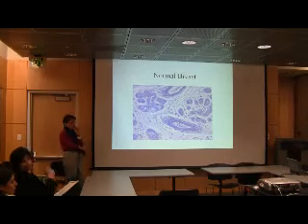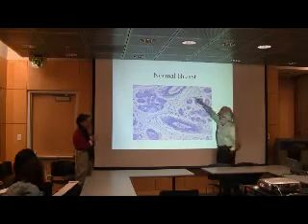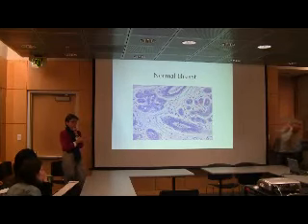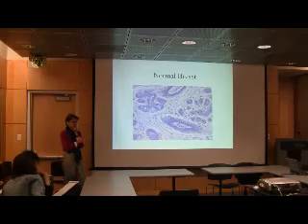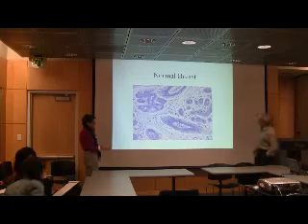How about the pink dots, red? Good question. What do you think they are? What color? Pink or red? Blood. Yeah, exactly. Those are blood cells. Those are red cells, erythrocytes, red blood cells.